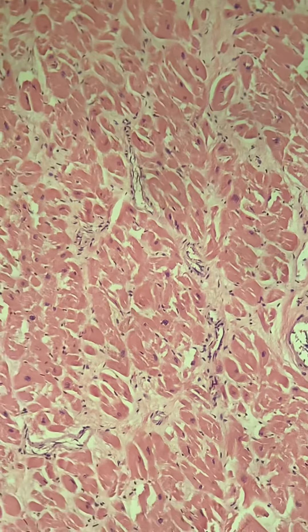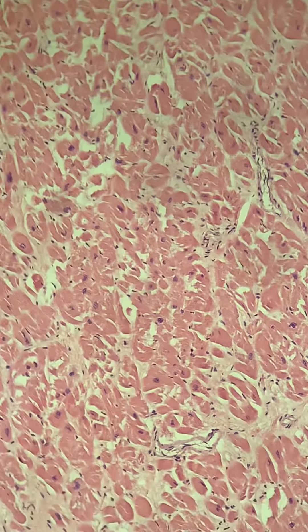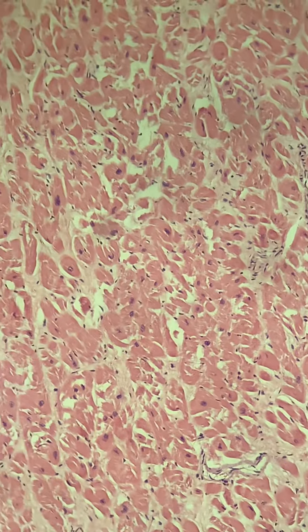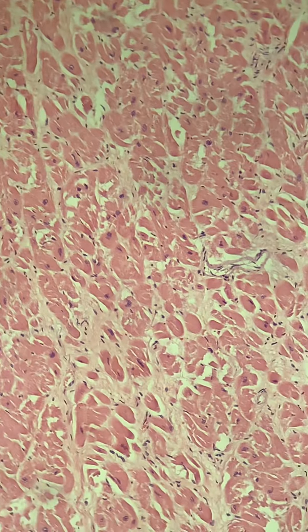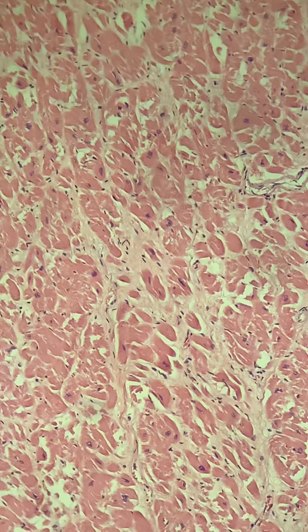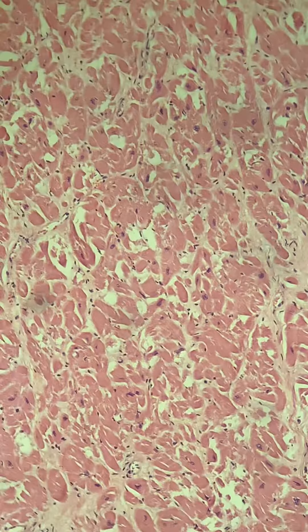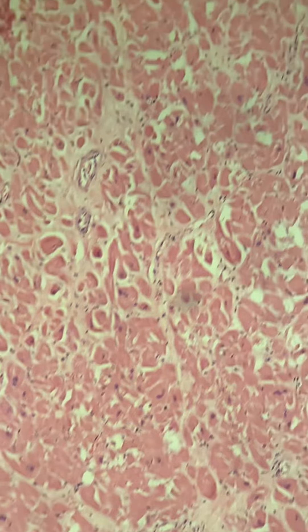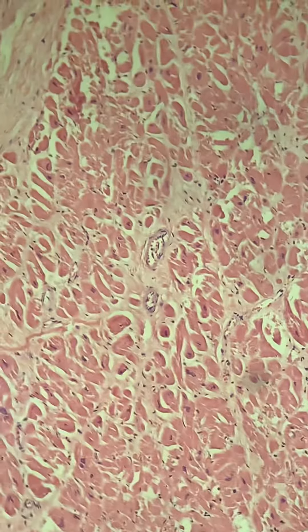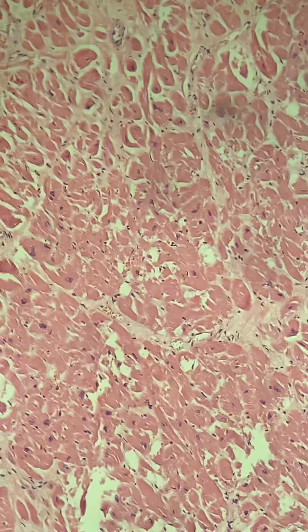You see more fibrosis here where you have replacement fibrosis in between the myocardial cells — the muscle cells of the heart. But those are still relatively healthy muscle cells, other than the mild ischemic changes. When you're 80 plus years old you're going to have some ischemic heart disease, but obviously this is not bad — not a reason for a person to be dead.